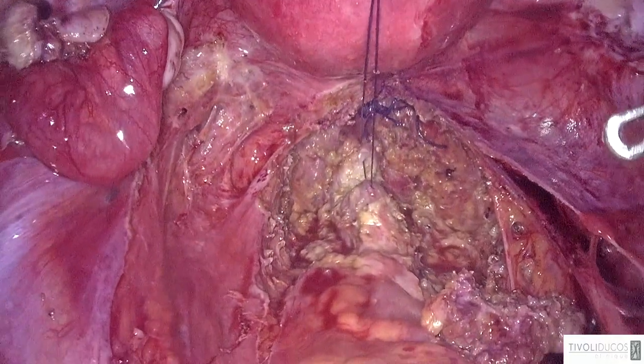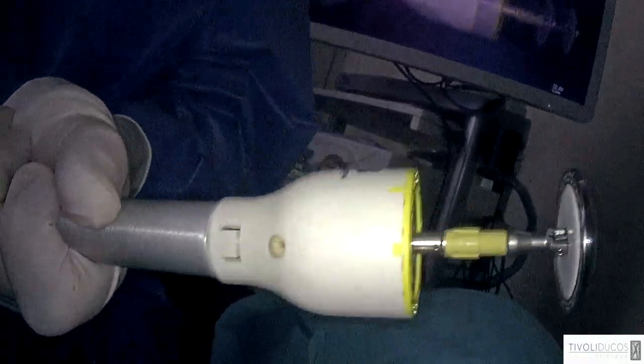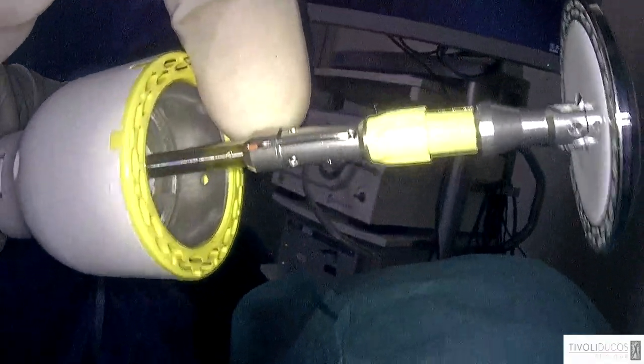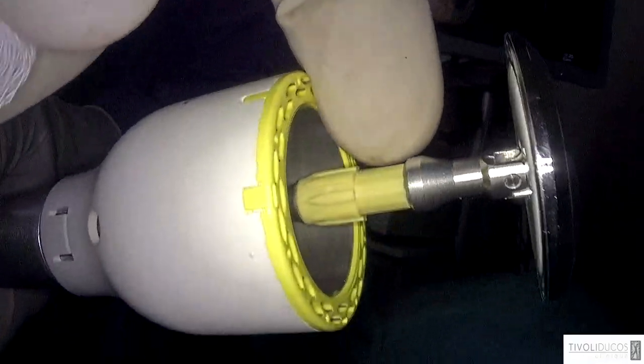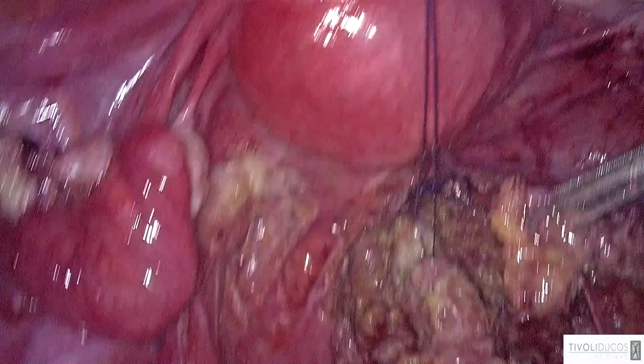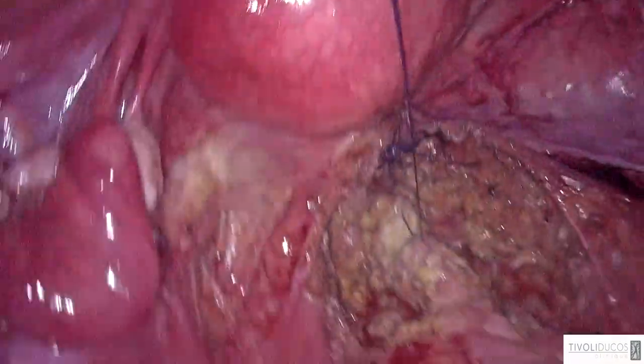Okay, very well. Now, Ahmed will leave his place, and between the legs we'll have our friend Damien. So, he's holding the stapler, and he will show you once more that he'll open the stapler into the rectum. I will carry out the knot pushing the shaved area into the stapler, and then he will close. And we'll see that we'll remove a piece of tissue looking like a calzone, you know, the pizza which is closed. And when we remove the staplers, we'll have the actual disc excision.